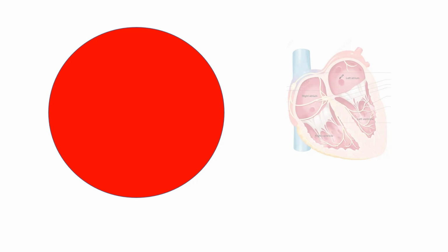Let's talk here. If we remember from the previous video, we have the heart and the axis is usually going to the left side. That being said, we are looking at the heart from different angles. So I will draw this circle and you have to learn how to draw it with me. Just memorize how we do it.